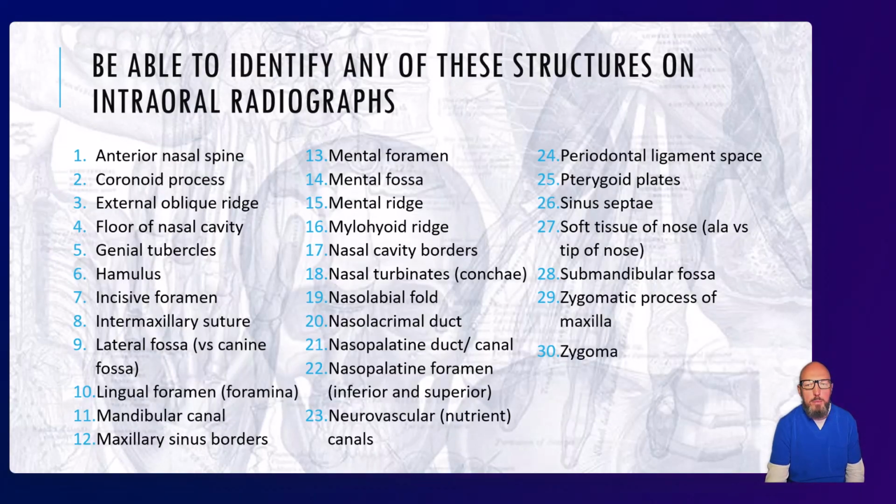All right, be able to identify these 30 structures. This list is not completely comprehensive, so check with me and make sure you have the most updated list, because I'll sometimes add and take away from this, just to keep things interesting, you know.